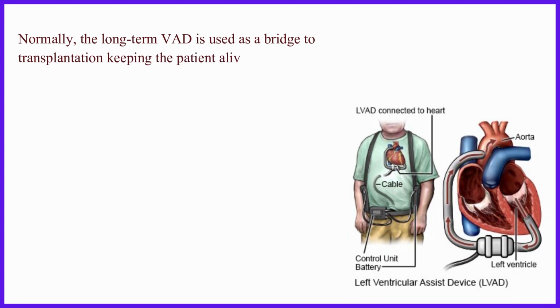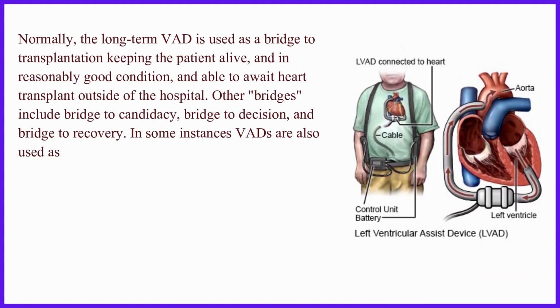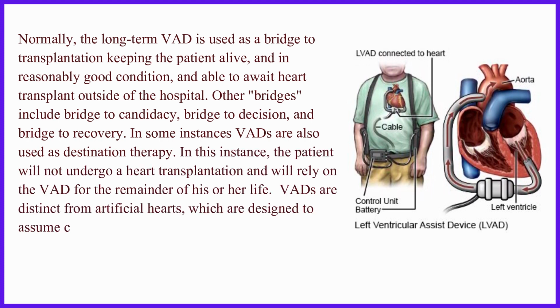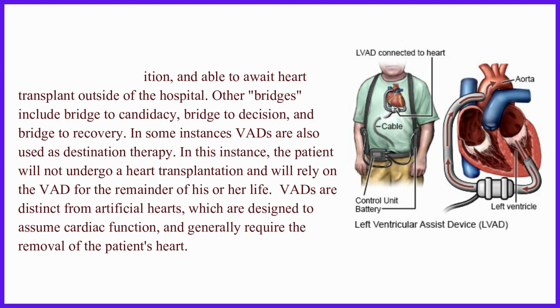RVAD. Normally, the long-term VAD is used as a bridge to transplantation, keeping the patient alive, and in reasonably good condition, and able to await heart transplant outside of the hospital. Other bridges include bridge to candidacy, bridge to decision, and bridge to recovery. In some instances, VADs are also used as destination therapy. In this instance, the patient will not undergo a heart transplantation and will rely on the VAD for the remainder of his or her life.